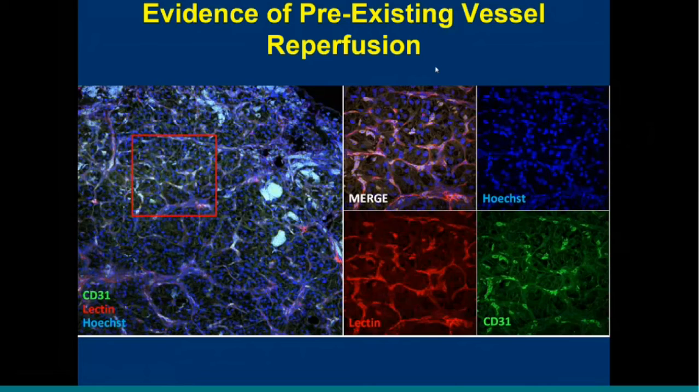And so for this case, just to guide you, this is a histology section stained with some immunohistochemistry. This is a merge image. We're focusing in here. We injected this particular CAM with an endothelial cell binding lectin, and that's shown in the red channel. And again, I apologize if you're red-green colorblind. But the lectin channel will bind to all of the active vasculature in this histology section. So these are the vessels that were actively perfusing within the CAM.